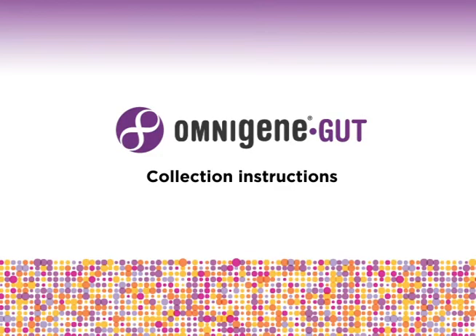This video demonstrates the instructions for collecting and stabilizing microbial DNA using Omnigene Gut.